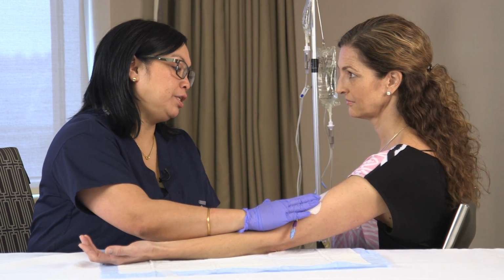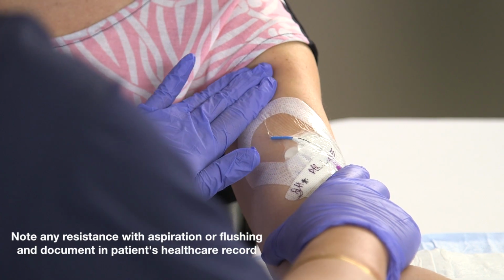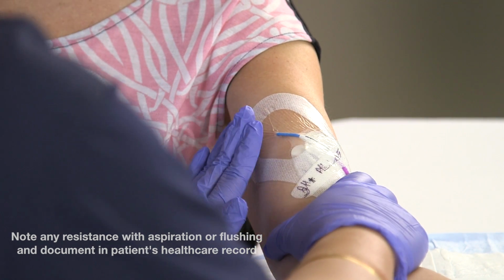Remember when assessing the patency of a CVAD to note any resistance with aspiration or flushing and document it in the patient's healthcare record according to your organization's policy.